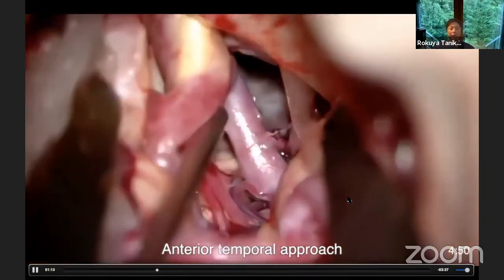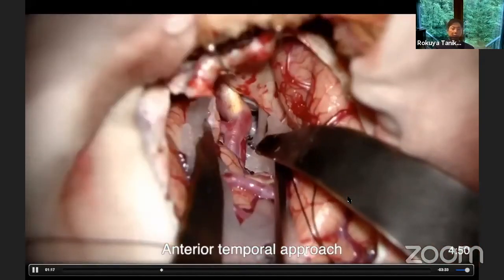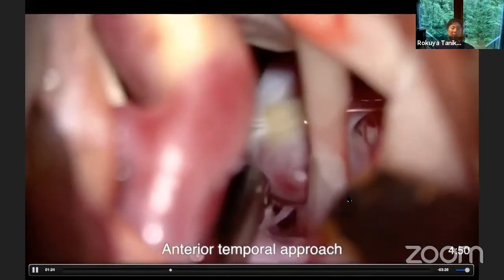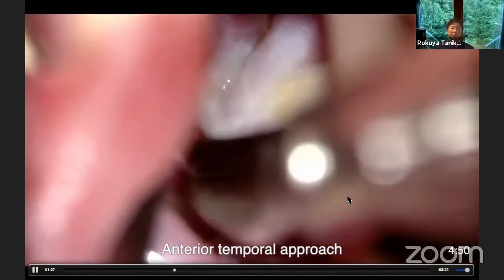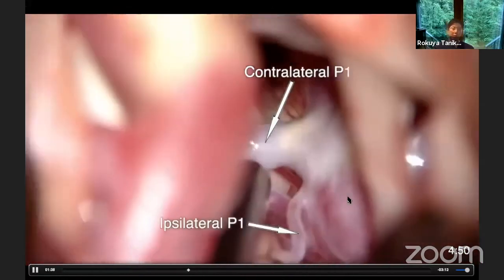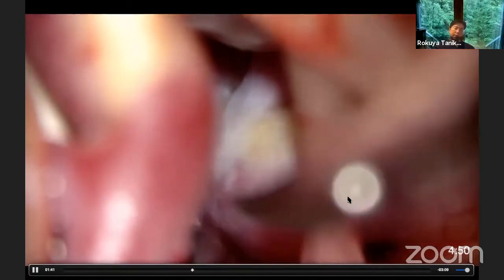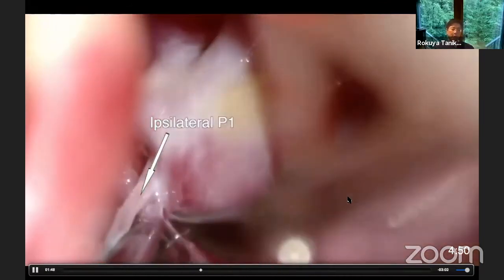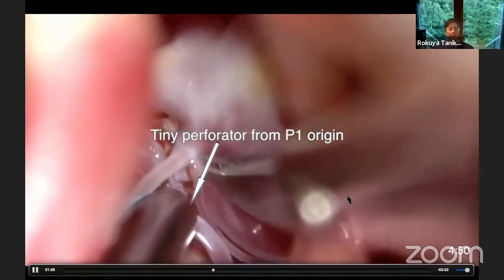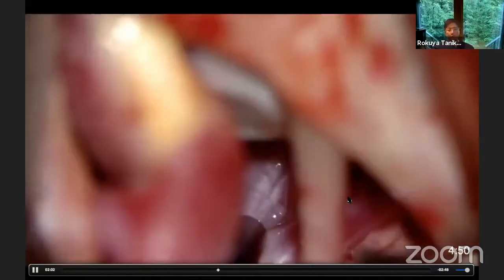P2A and P1 are now exposed. At this moment we can confirm the aneurysm just under the oculomotor nerve. A very small P1 is just distal to the aneurysm. The contralateral P1 and the contralateral oculomotor nerve are just below the contralateral P1. I am confirming the anatomy, because there are small perforating arteries arising from the very proximal tiny P1. I am dissecting the connective tissue between the aneurysm neck and the tiny perforators.